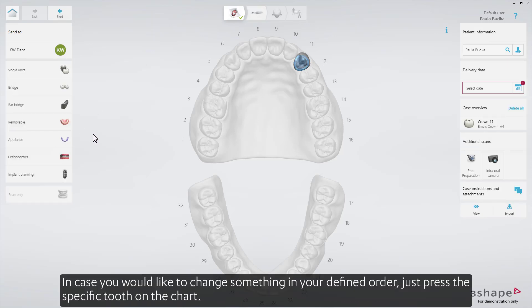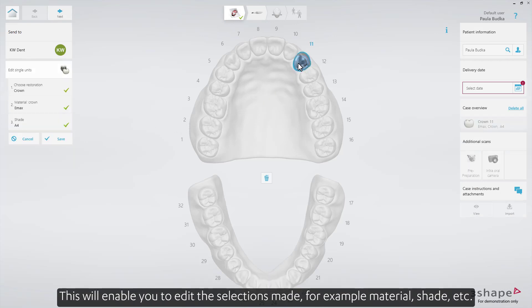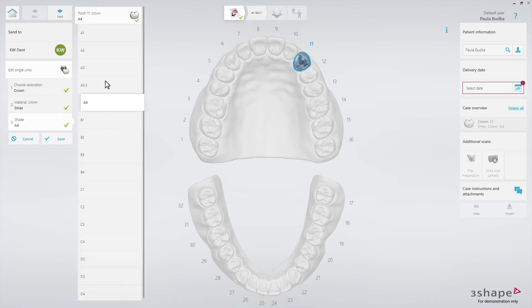In case you'd like to change something in your defined order, just press the specific tooth on the chart. This will enable you to edit the selections made, for example, material or shade.